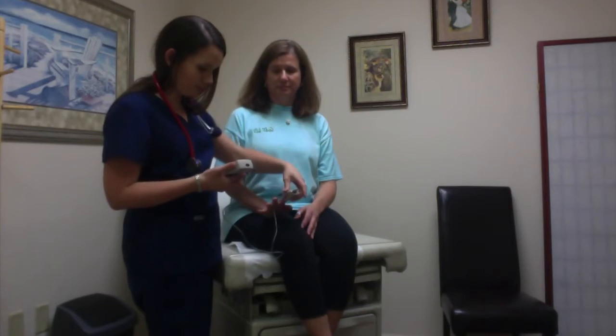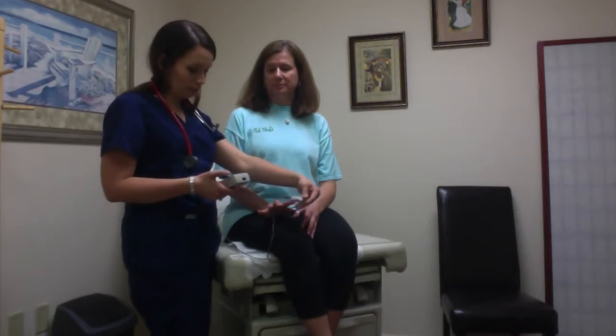And finally, I'll take her temperature. And her temperature is 98.6. Okay. And then I would also assess her oxygen level. So I'll get my pulse ox here. And her oxygen level is 97%, and this also says her heart rate is 80 beats per minute. And I would also usually assess her height and weight. Fortunately, this patient knows how much she weighs and how tall she is, so we have already calculated that. Okay, we can pause.